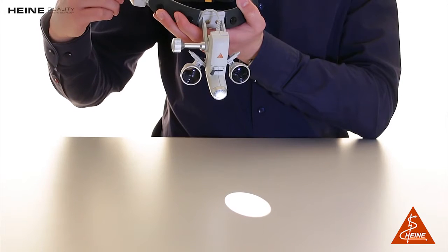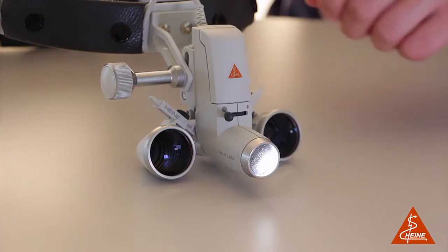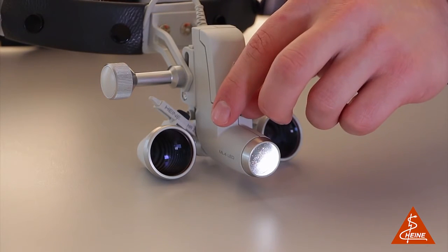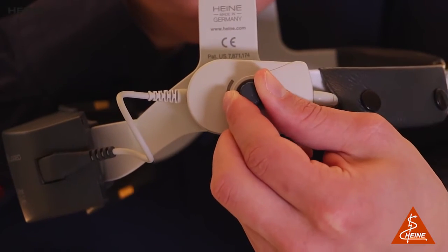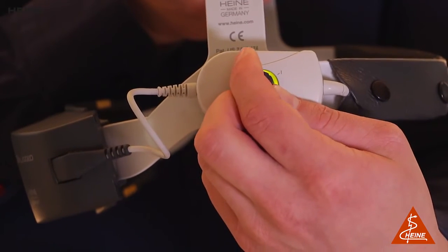In terms of functionality, we can highlight the adjustable illumination spot size and the stepless light intensity control. The spot size ranges from 30 to 80 millimeters at a working distance of 420 millimeters. The ideal brightness for any given examination can be adjusted precisely with the stepless light intensity control in order to prevent reflexes.